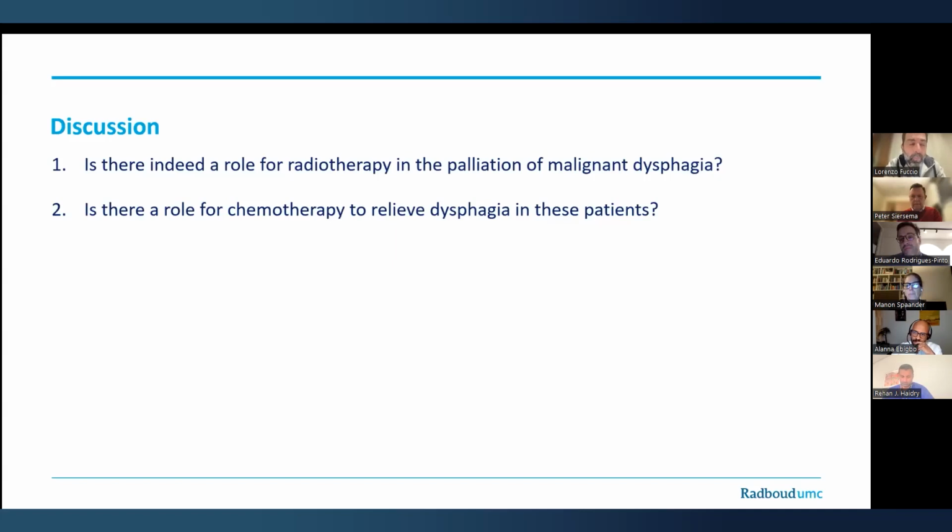This is very important, because when you have the stent inside, the mean dose that you provide to the tissue surrounding the stent cannot be controlled with the old technology. If you perform VMAT, for example, the range of variation is about 3%. If you go with the older technology, this goes up to 20%. So in this way, you can't control exactly the dose that you are irradiating the tissue.